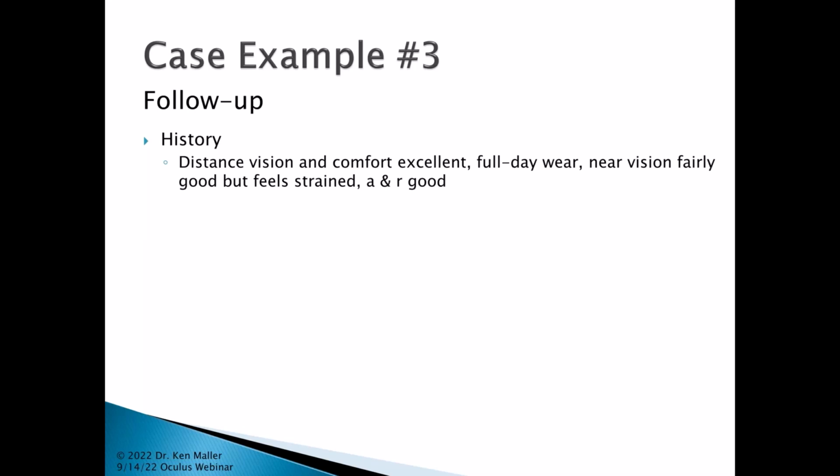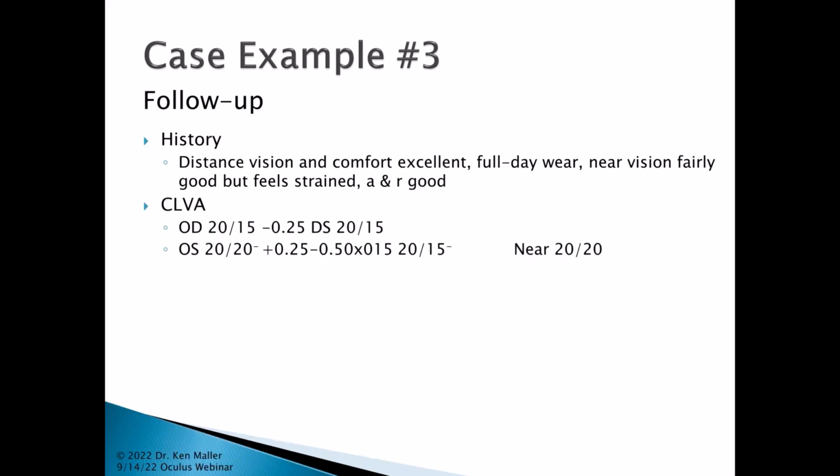Near vision is fairly good, but she feels a little bit strained, and she's doing pretty well getting them on and off. Vision on the right eye is maintained very nicely at 20/15 with the minus quarter over refraction. Left eye, again, she's doing very, very nicely with that. Just a touch of cylinder there, and the near is still doing very, very well.